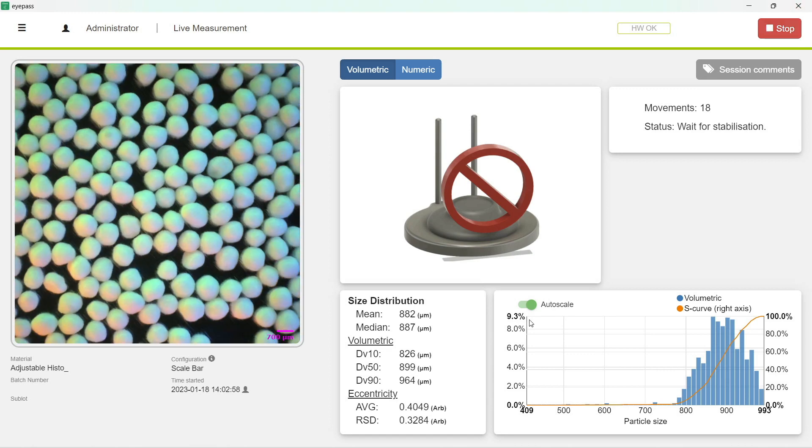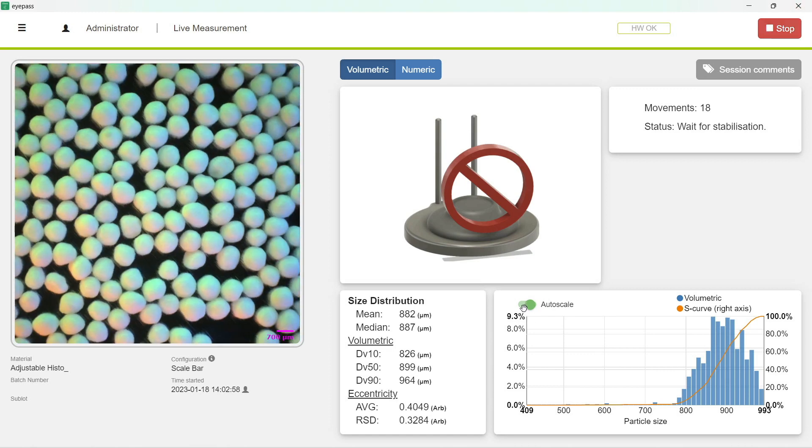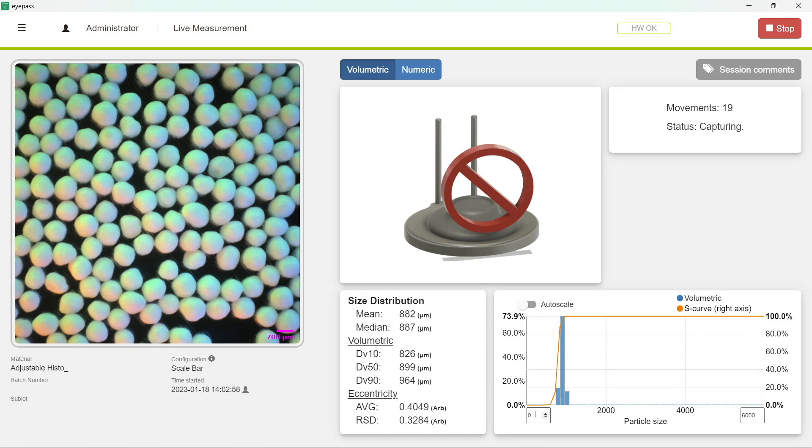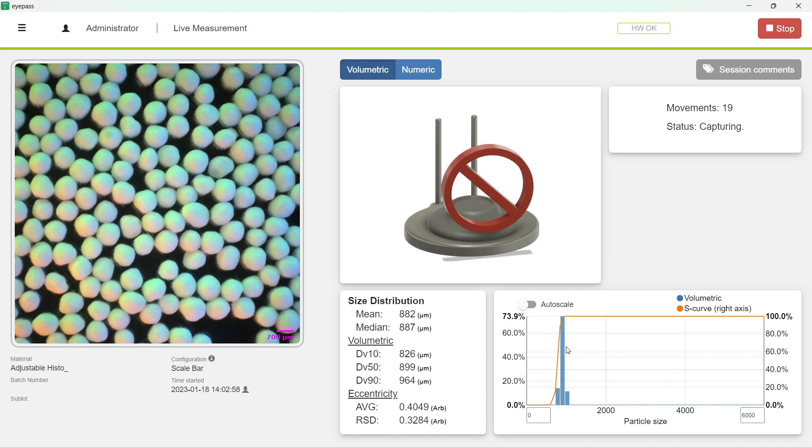Right now we have it on, but let's turn it off to go back in time a little bit. Before we had added this, it used to go from 0 to 6,000, and as you can see, it doesn't show so well the distribution of your particle size if it's a narrow range.